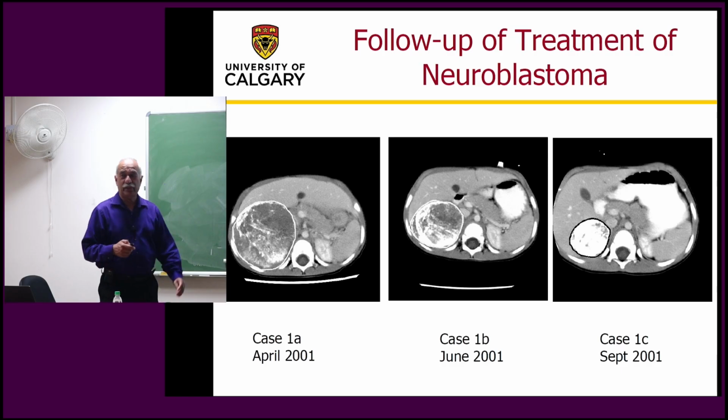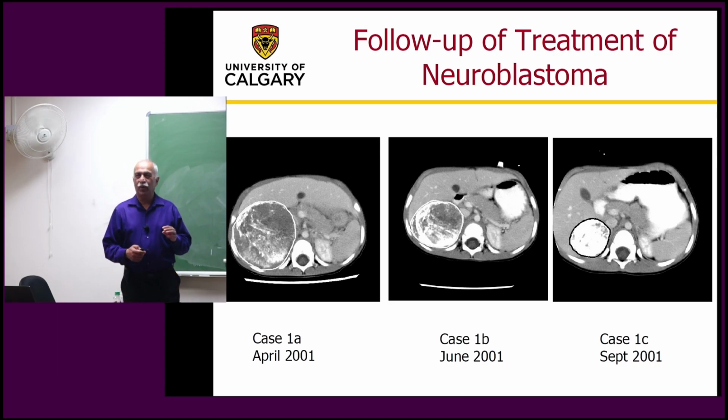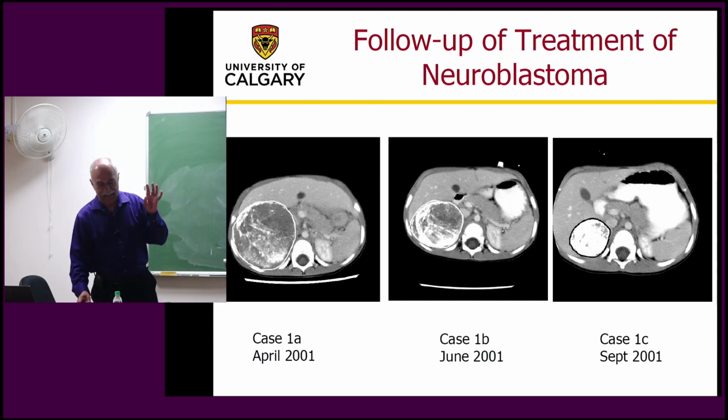The next step we wanted to do was to analyze the follow-up of treatment of neuroblastoma, or response to therapy. So not only diagnosis. For this we made use of the contours drawn by the radiologist.